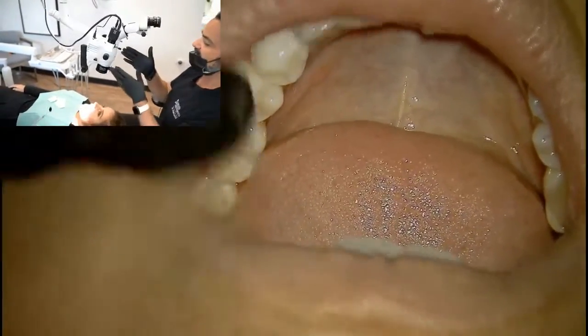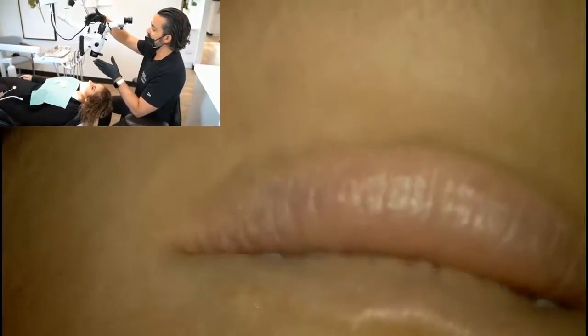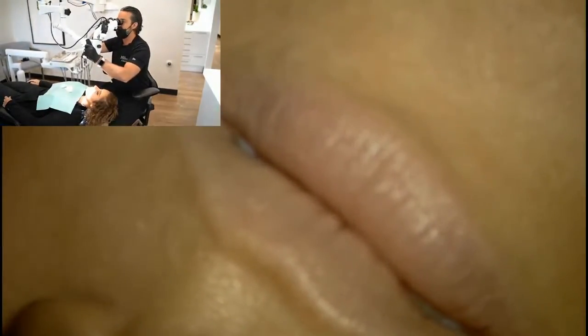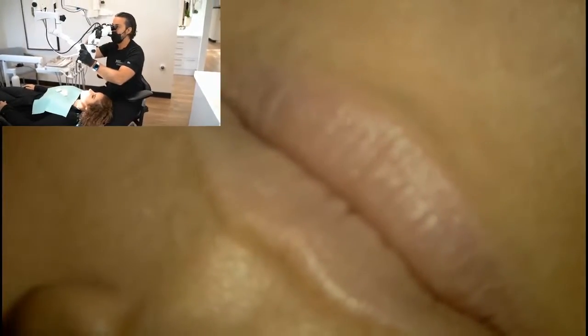There are always corrections. The articulation points of the microscope are in the arm, and in the microscope I have this ability, and then I also have this ability. If you want to work from this side, you can put the microscope off axis like this, and then instead of my head being like this, I can rotate it back up and keep correction.